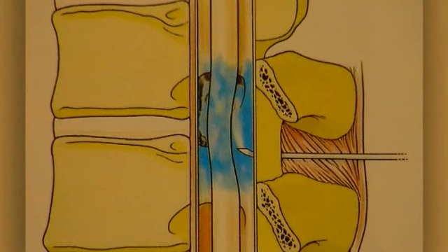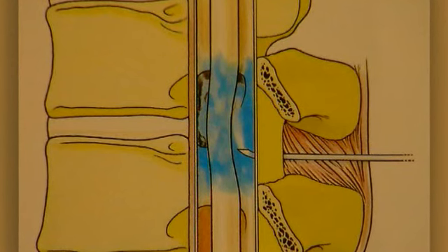As the needle approaches the epidural space, the constant fluid flow encounters changing variations in resistance. This resistance is dependent on the type of tissue encountered by the tip of the epidural needle. The variation in resistance means the APAD tone pitch also constantly changes. When the needle reaches the ligamentum flavum, the tone pitch increases considerably, and when reaching the epidural space, the tone pitch suddenly drops. If, with a running pump, the pressure does not rise anymore, the anaesthetist can be 100% certain the tip of the epidural needle is in the epidural space.